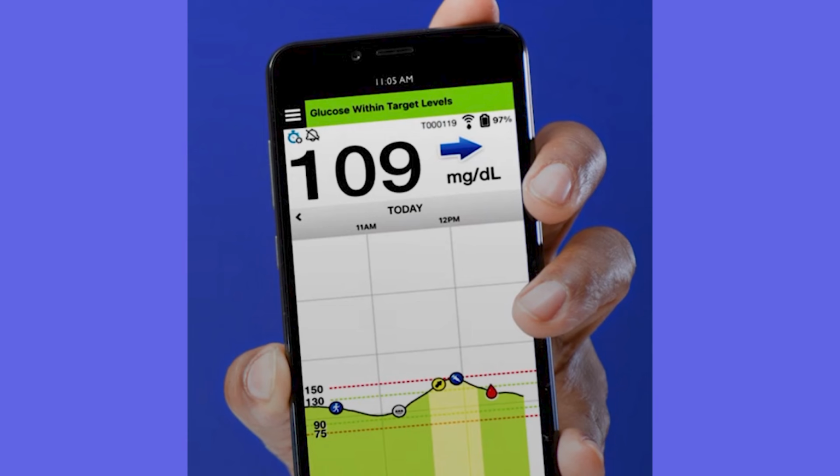Now, if you're on a plane, you've got your Bluetooth on. Yes, all of it's going to go right to the phone itself. And then as soon as you touch down and get back inside of cellular connectivity to the cloud, it's going to update it and push it all to the cloud. So it's all full function and capability.